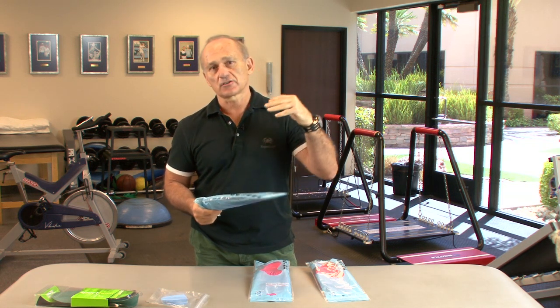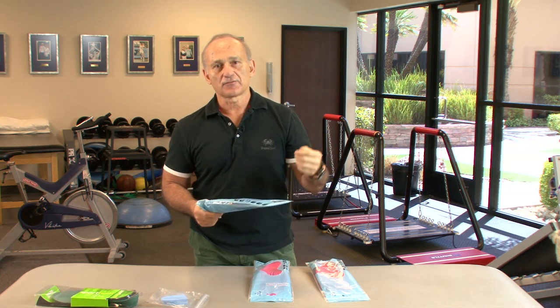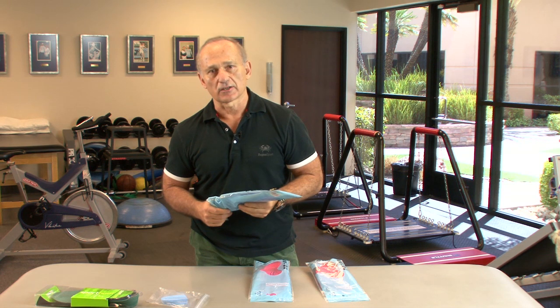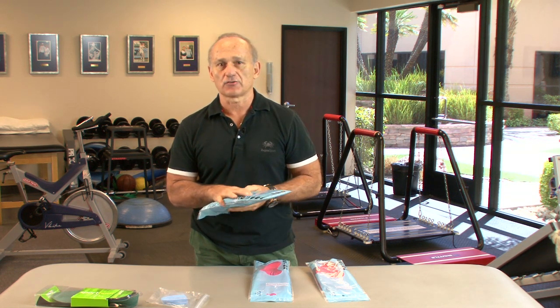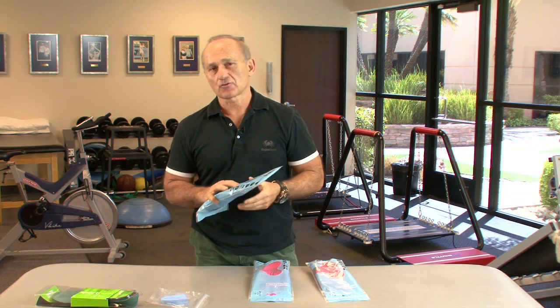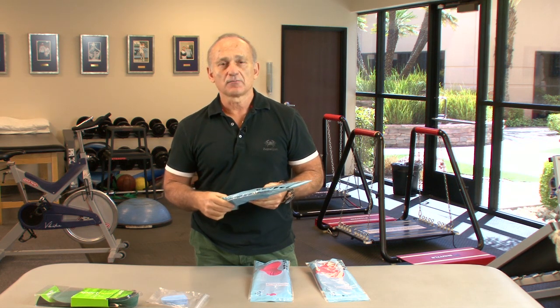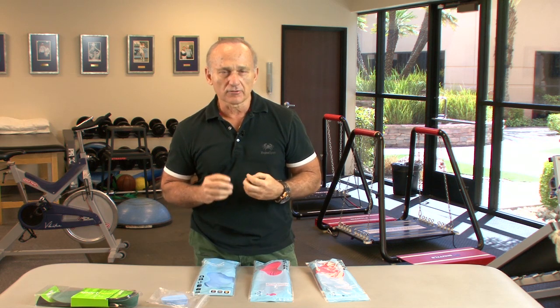How much is the person overpronating? Is the medial arch collapsing? Is the forefoot unstable? Is the rear foot moving into eversion too much? We're going to try to control those different aspects of pronation through the use of these orthotics. And again, the best way to control that is by trial and error. There is a certain objectivity to this, but you have a product like this that you can make adjustments to literally every single time the patient comes back.